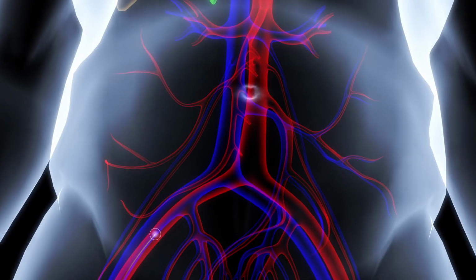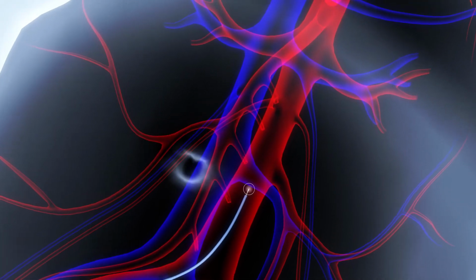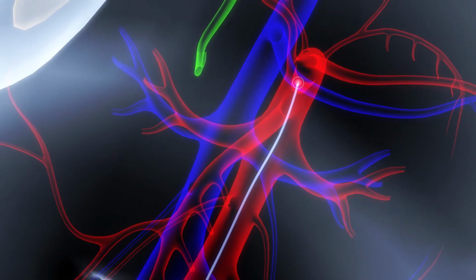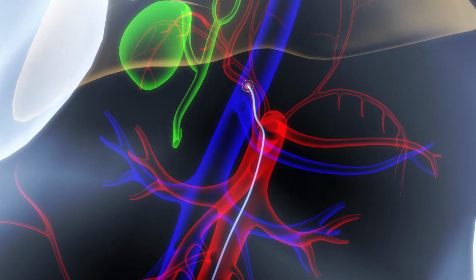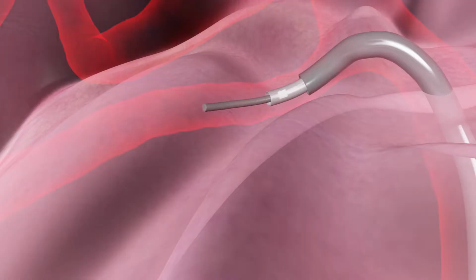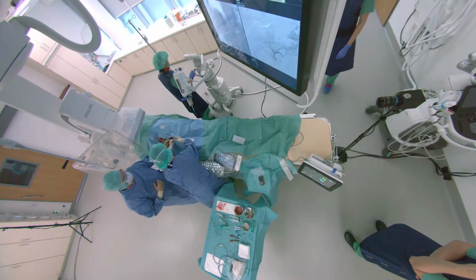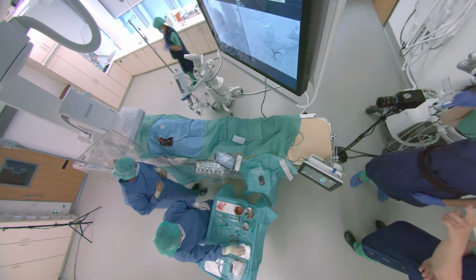The catheter is advanced from the femoral artery to the celiac trunk, and then more selectively via the proper hepatic artery into the right hepatic artery. Once the catheter is in the correct position, the system is set up to perform a dual Expert CT scan.